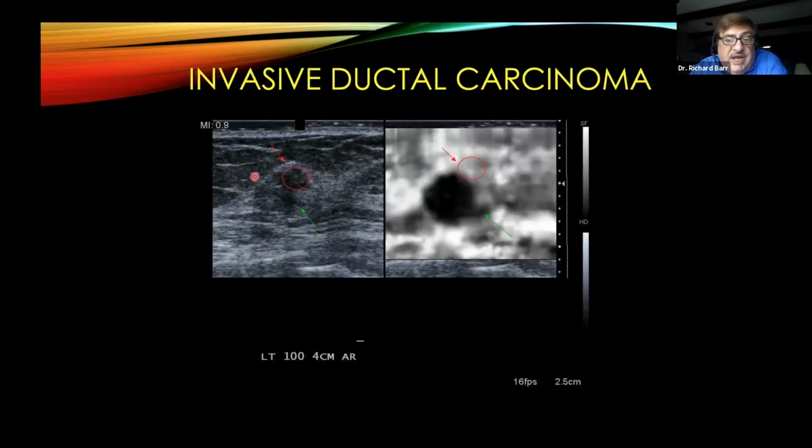This is a lesion that I learned the most from, a new lesion on mammography. We try to do all our biopsies on ultrasound. I like to say this lesion had a body, a tail with a green arrow, and a head circled in red. When we do our strain elastography, the body and tail get larger, the head disappeared. So this patient we did a biopsy, it was invasive ductal cancer. She had her lumpectomy. I asked the pathologist to pull out the slides, and the head actually was a benign fibroadenoma. So the elastography correctly predicted that this was benign and this was malignant.